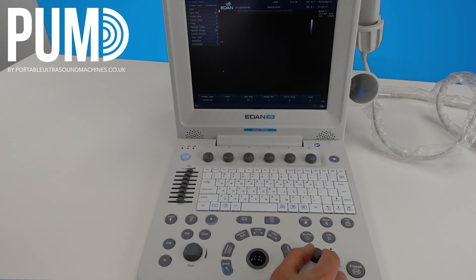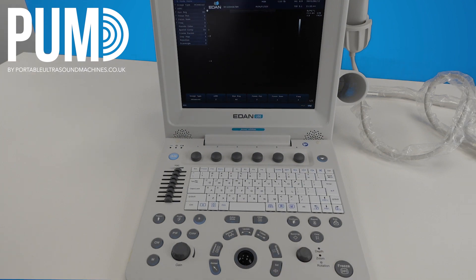The knob next to freeze will be your depth — turn it anti-clockwise to decrease your depth or clockwise to increase it. You also have a zoom feature on this button: click it in and you'll get a zoom box. You can adjust the size of this using the control knob, put it in the right position using the trackball, and then set to zoom in to that specific point. You can save that if you want, and if you just want to go back to your normal image, hit B to go back to your standard imaging.